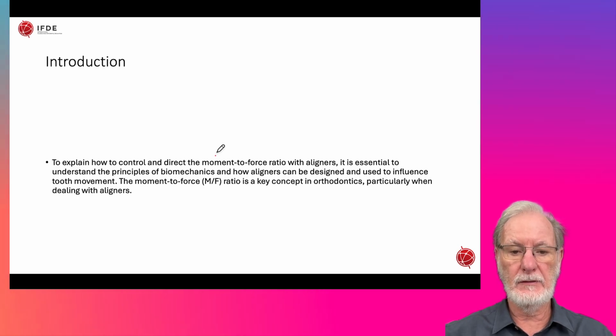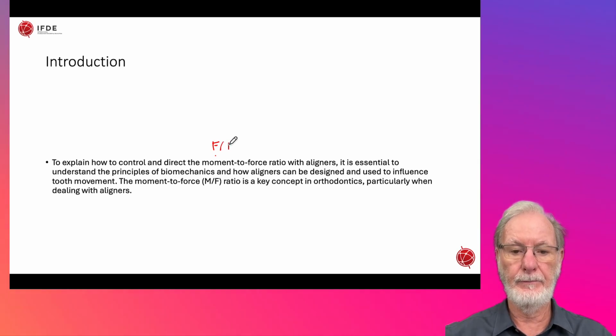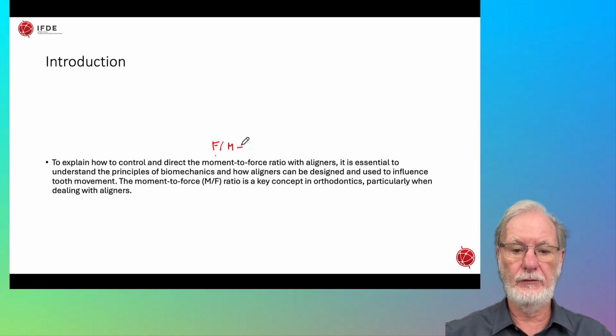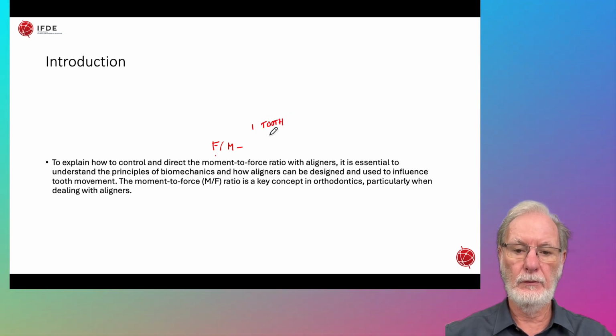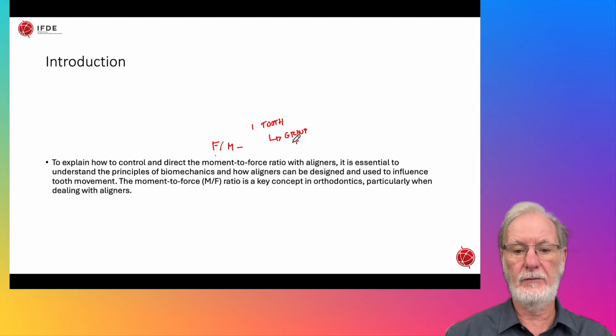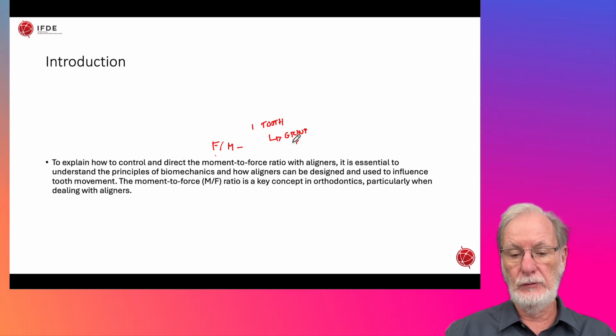Again, very important concept where you have a force and a moment applied to one tooth, and then also what happens when you apply the same concept to a group of teeth. And aligners again are completely different because you can stage, as you know, the deformation of the aligners to obtain the requested or required movement.